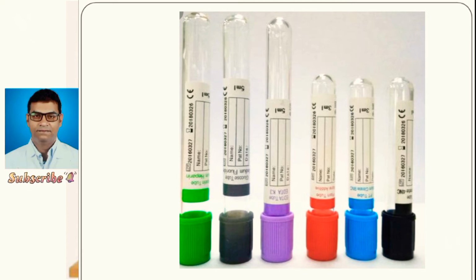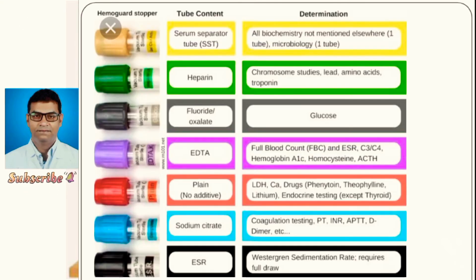Heparin. Heparin is an acid mucopolysaccharide, and it acts by complexing with antithrombin to prevent blood clotting. Antithrombin is one of the natural or physiological inhibitors of blood coagulation. It is not suitable for blood film staining, since it gives too blue a coloration to the background when films are stained with the Romanowsky stain. Also, heparin may cause leukocyte and platelet clumping. This is why heparin is not suitable for routine hematology.